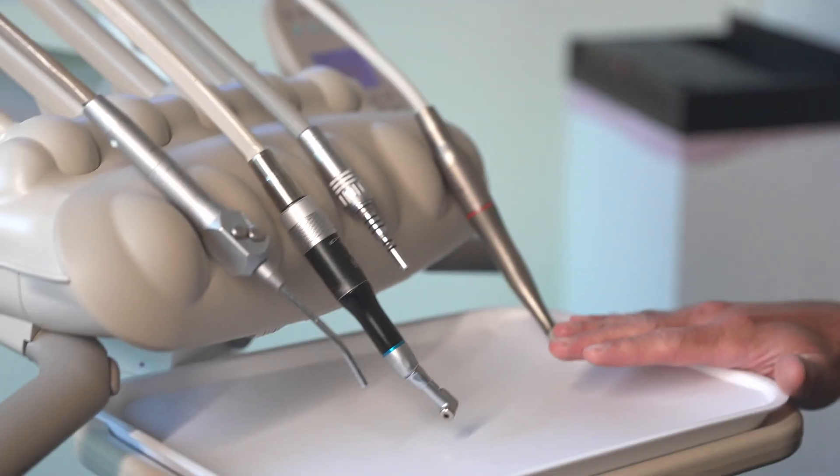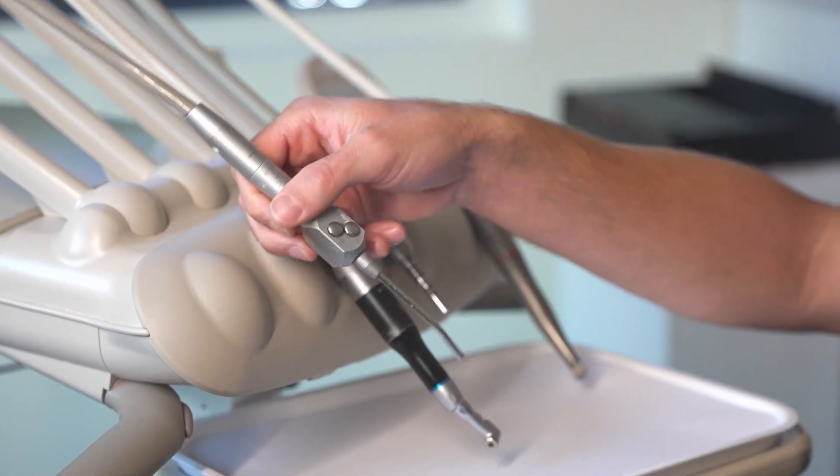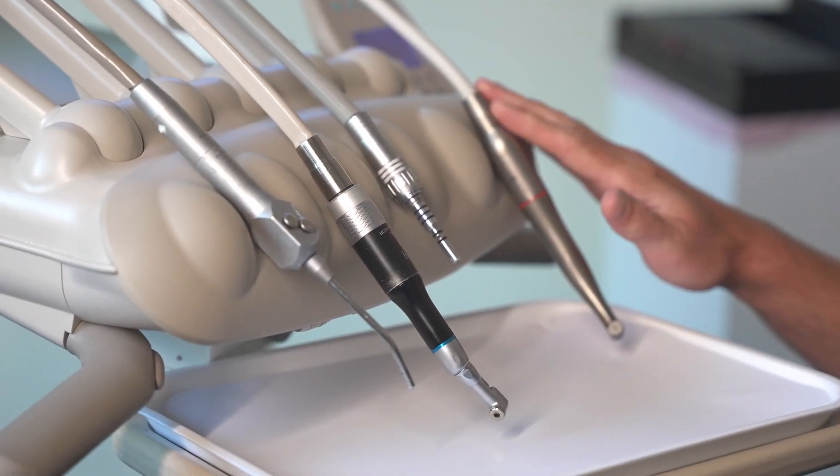Now for the other side. Here we have the tray where the dentist places instruments. Again, we have the air water syringe for the dentist — the other one was for the dental assistant. And here we have our high-speed drill and low-speed drill. That's what's creating most of the water in your mouth, and that's what the suctions are for.